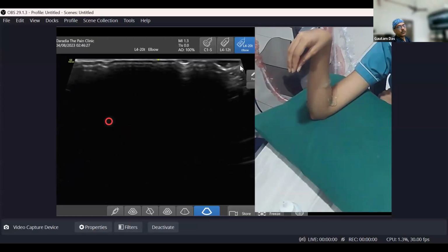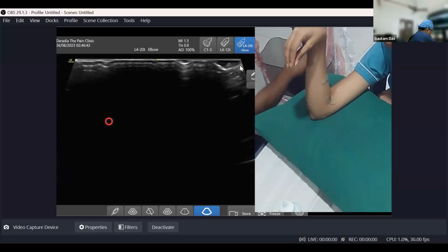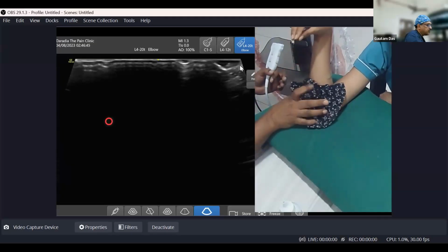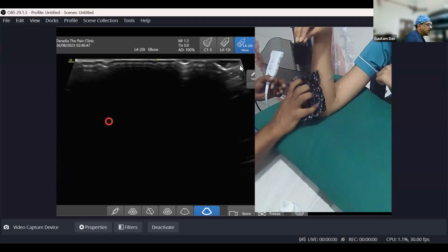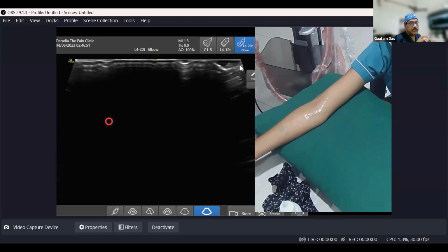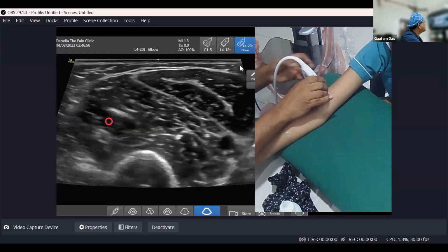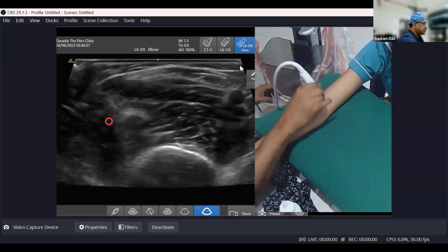So that way also you can go for the injection in the tendon if the patient has distal biceps tendinopathy. That is not very common, but again, not uncommon. So this was about the distal biceps tendon. Let me wipe it out. And another thing in the anterior elbow is left. I have shown you the median nerve, and now I have to show you the radial nerve. So radial nerve, again come to the home page. I will take it clear.